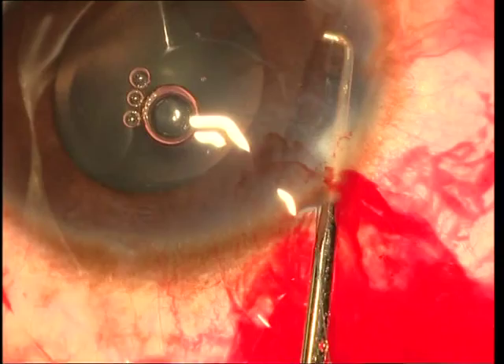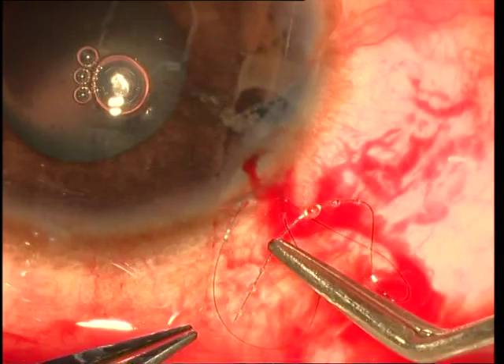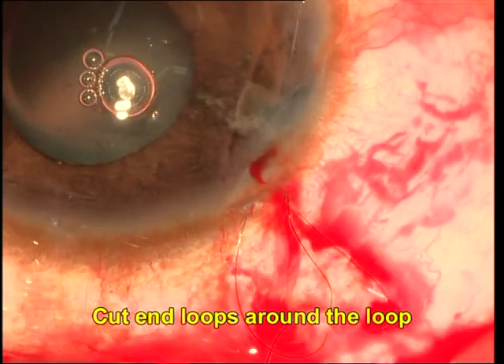A Sinskey hook is now used to grasp the portion of the suture which passes beyond the second leaflet, and this is hooked out through the first paracentesis so that there is a loop of suture lying out through the first paracentesis. The cut end of the suture is then looped around this loop three or four times in order to create a knot.